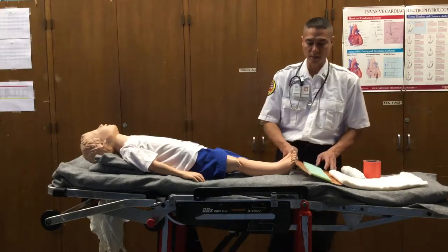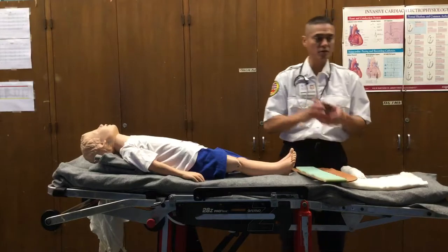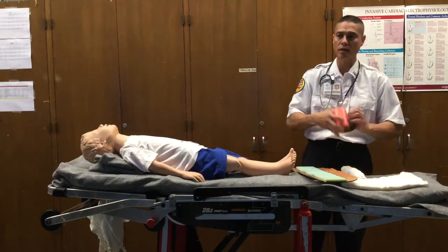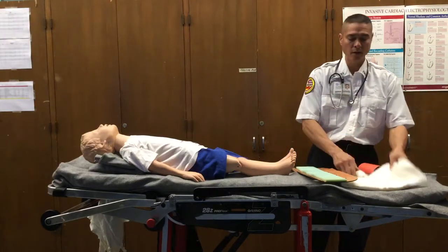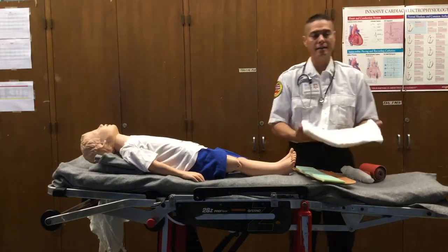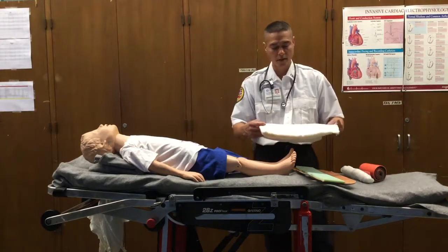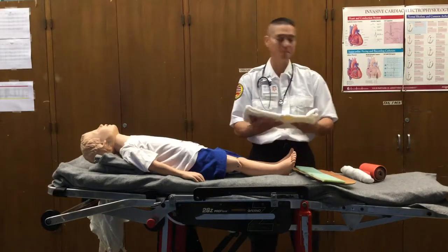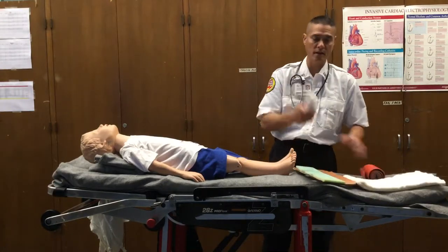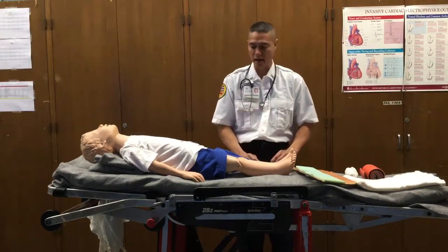So you'll be using a splint. Now there are many different types of splints: cardboard splints, commercialized splints. This is a SAM splint — it's very moldable. We can unroll this and it can conform to many different shapes and sizes. We can even use large padded devices such as a blanket. In this case, I'm just using a large trauma dressing that can be used as a type of soft padded splint, and then we would need our roller bandage to secure it down.